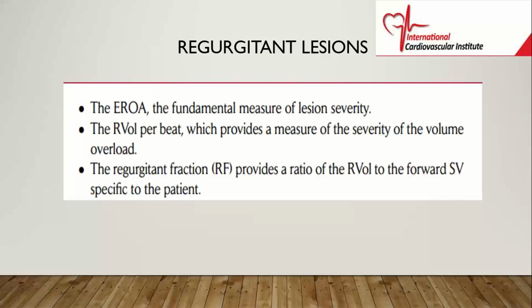So again, when you have regurgitation, it's not through an anatomic area, okay? It's not through an anatomic area. The regurgitation is going to occur across an effective area depending on the severity. If the regurgitation is more severe, then that EROA is going to get larger. So it's not a fixed area. Other things that we can look at is regurgitant volume per beat.